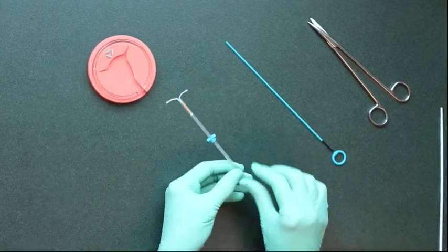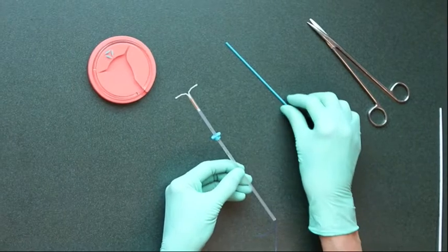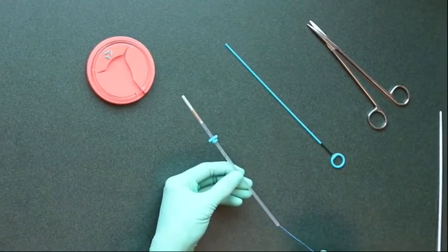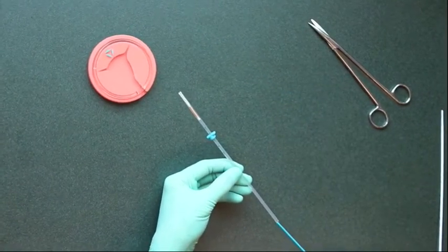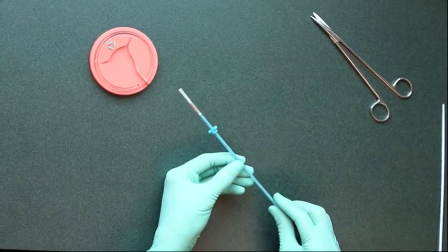Then position the blue flange at the right level. Then pull the IUD into the insertion tube using the blue nylon threads. Then put the plunger into the insertion tube.